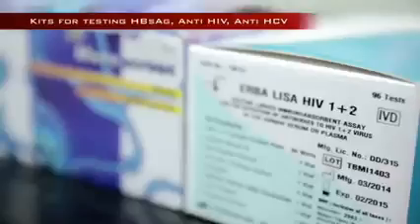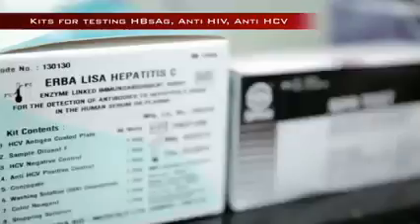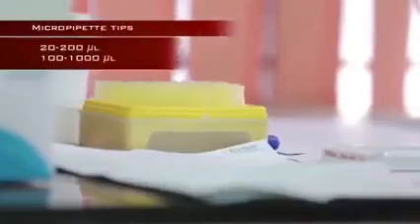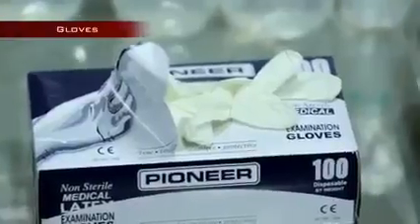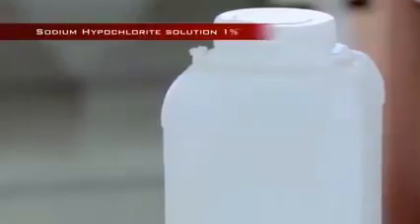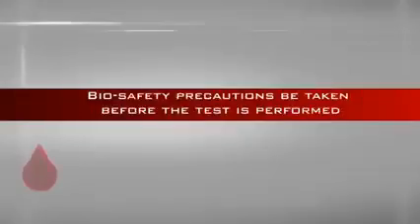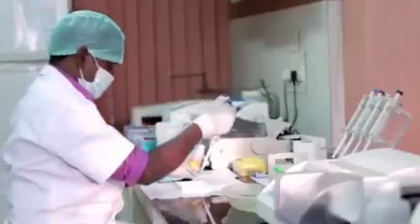Consumables: kits for testing anti-HIV antibodies, HBV surface antigens and anti-HCV antibodies, micropipette tips 20 to 200 microliters, 100 to 1000 microliters, gloves, test tube racks, 1% sodium hypochlorite solution, distilled water, tissue paper, marker pen. It is important that biosafety precautions be taken before the test is performed. We now proceed to see how the ELISA test is performed.